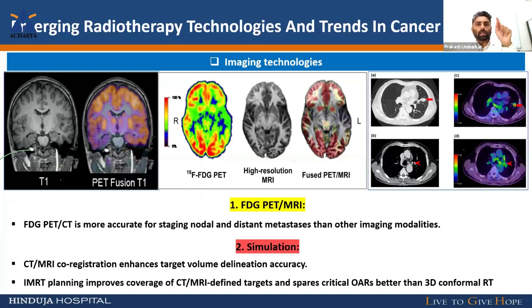Suppose your marking or contouring is drawn wrongly, indirectly we give an insufficient margin or an extra margin. If you give an extra margin to the volume, it means the normal tissue also gets more radiation. So we want clear imaging. We can use PET CT imaging, FDG imaging or high quality enhancement, so we get more information. So imaging is very essential for radiotherapy technology.